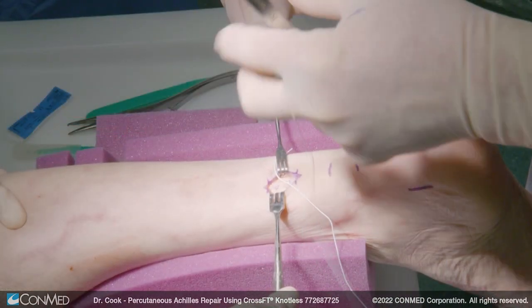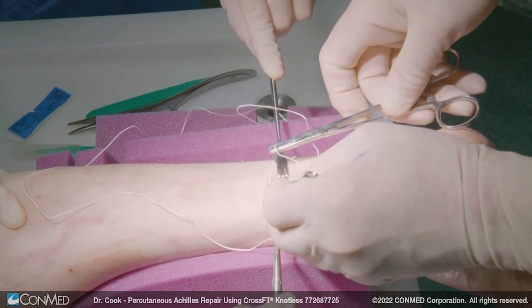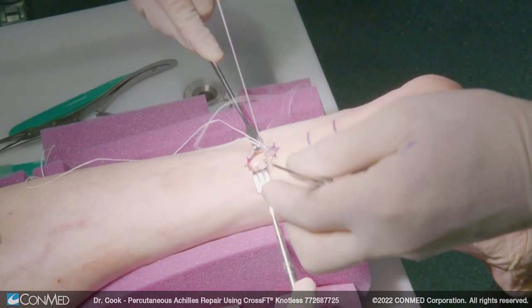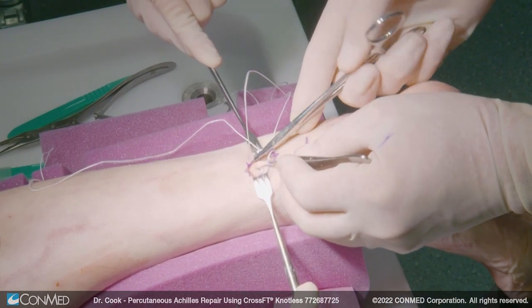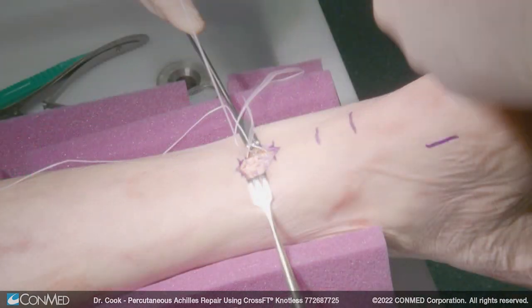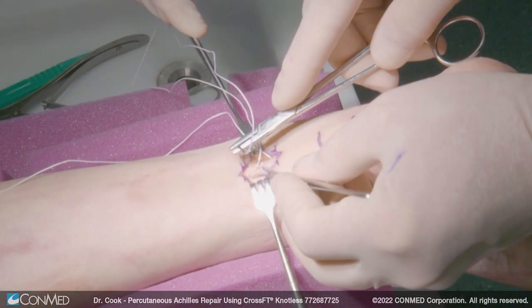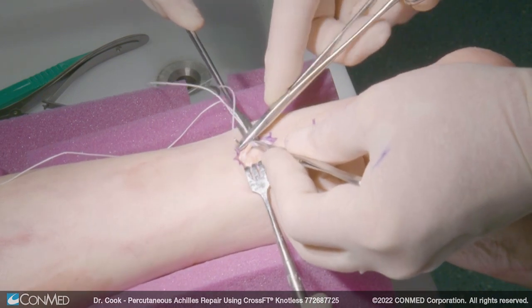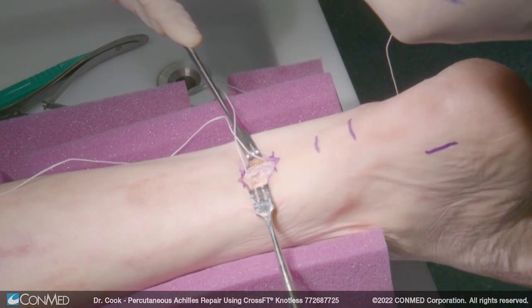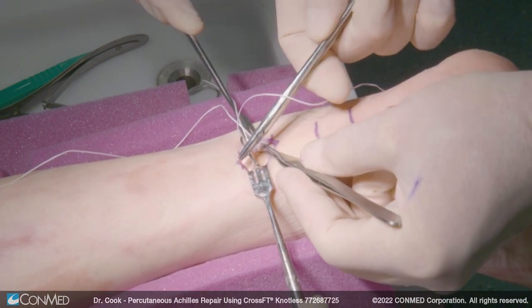We're just going to do a typical Krakow stitch, so we'll start here and work our way up. Simple, very strong, much stronger than pure percutaneous techniques. We go across so we can come down. It'll be about minimum three — you can do more if you wanted to, and you can extend the incision as high as you want — but three good Krakow stitches ought to give us a very good purchase.